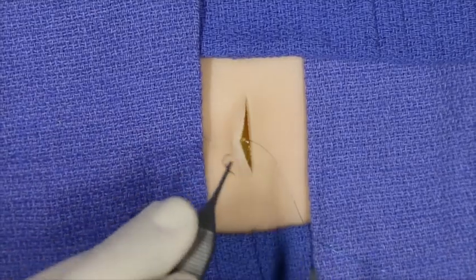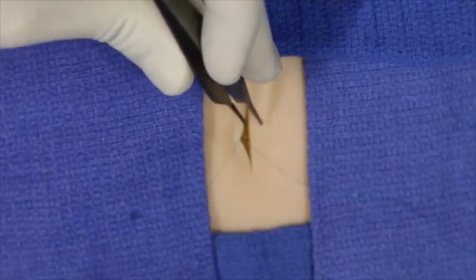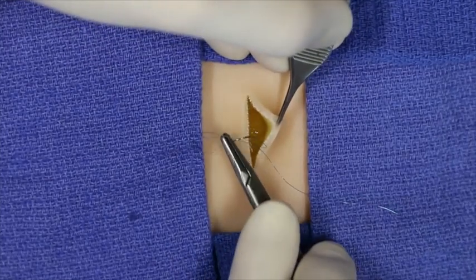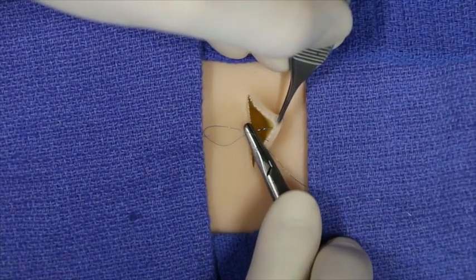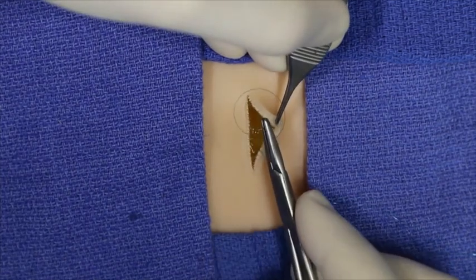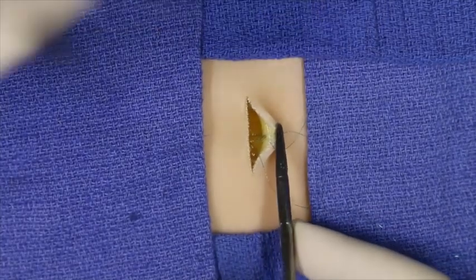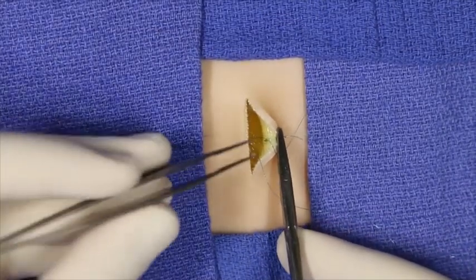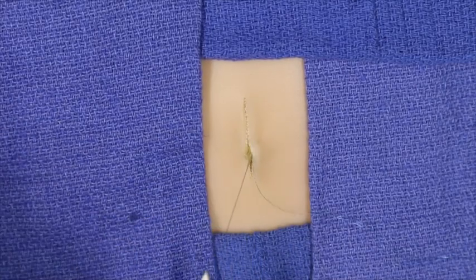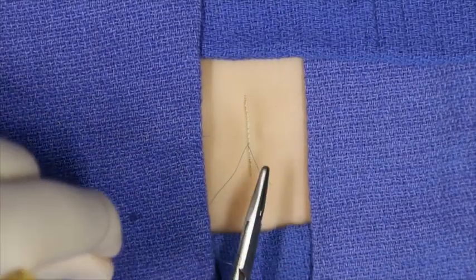The needle is re-grasped and loaded immediately, and then the same procedure is repeated on the contralateral side. The wound is reflected back, the needle is inserted through the underside of the dermis, now heading outwards more distally, exits again further set back on the underside of the dermis, re-grasped and pulled through. The suture material is then pulled through and tied.